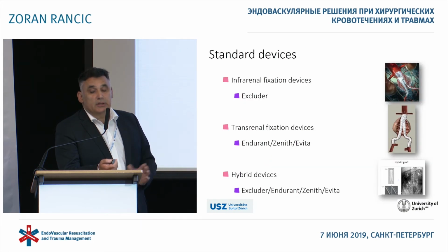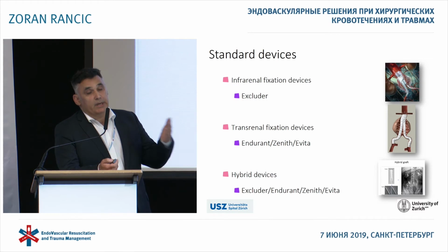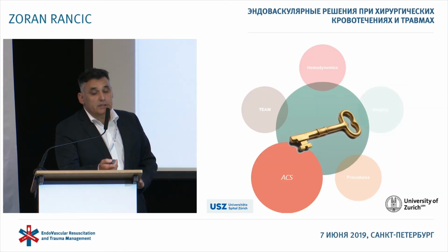Procedure, I'm not going to take a lot of time for the procedure. For us, the EVAR procedure is the same as a normal elective EVAR, just in case of rupture, where we have stress and hemodynamic instability. We are also using parallel grafts.